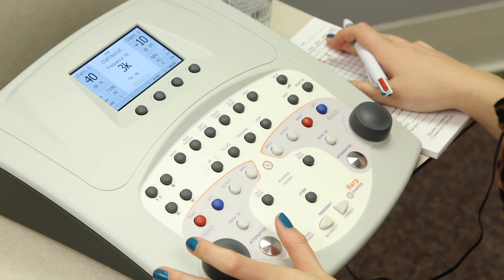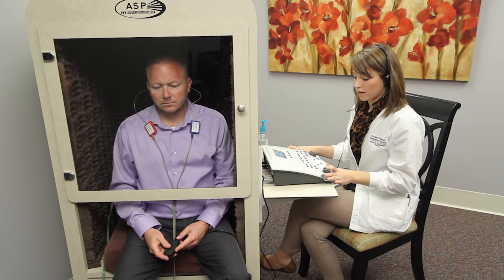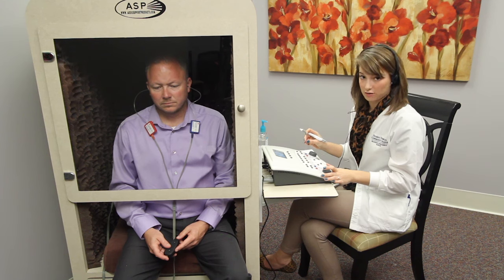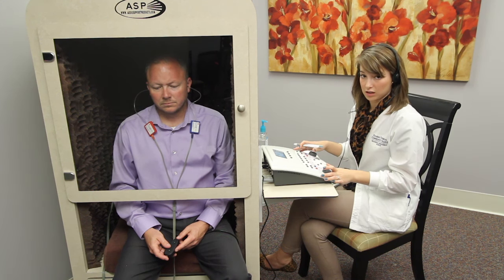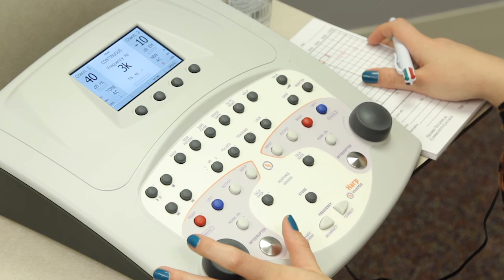As you may have seen with the right ear, I tested 3000 Hz, and that is because 3000 Hz is the closest to the resonance peak of the average adult ear canal. Normally, inter-octaves are only done when you have a 15 decibel gap between your octaves, so we're going to do 3000 Hz here, and that is why I skipped 6000 Hz.